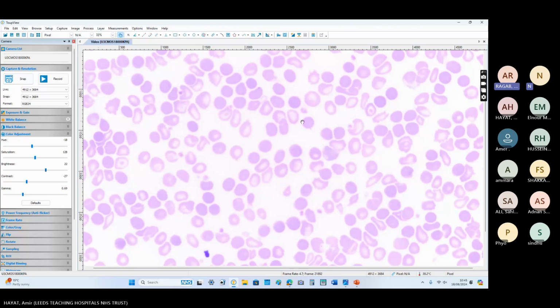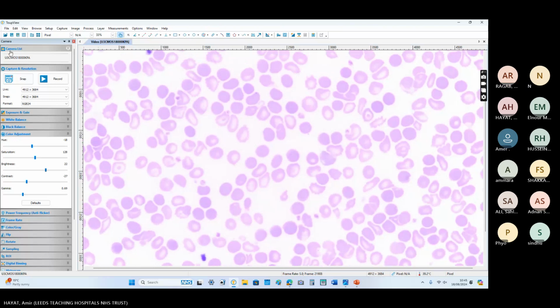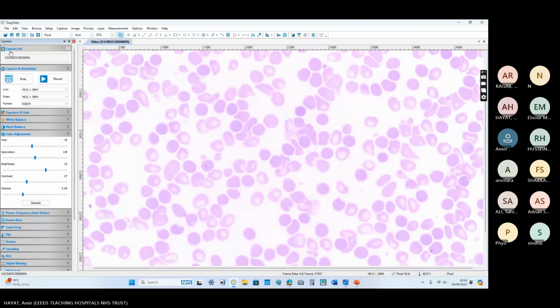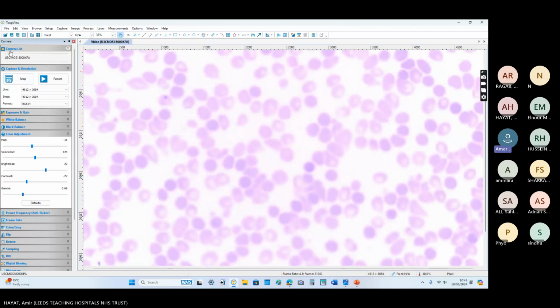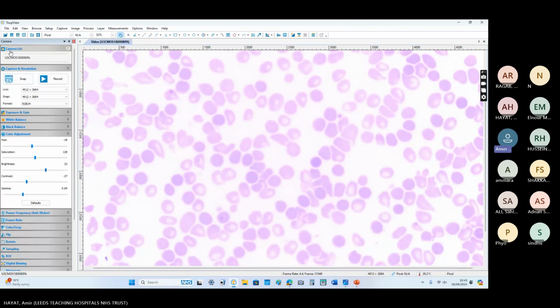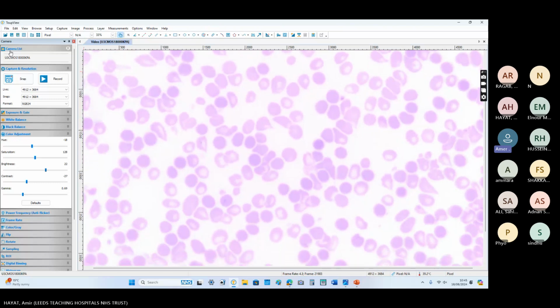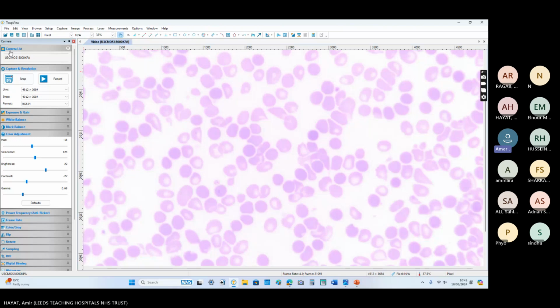It's 1 o'clock. Okay. Right. So you can expect such a question in the exam as well, like write 6 points, because the report is for 6 marks. So they asked us to write 6 points on this blood film.